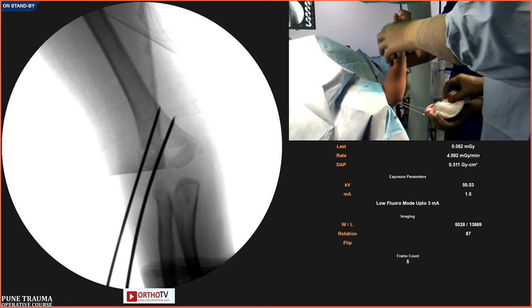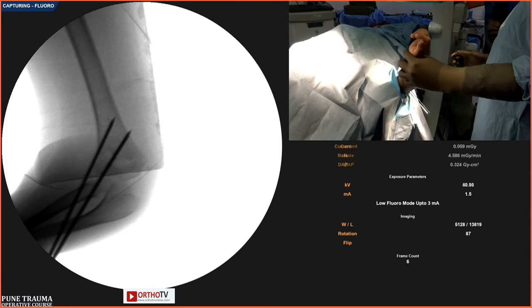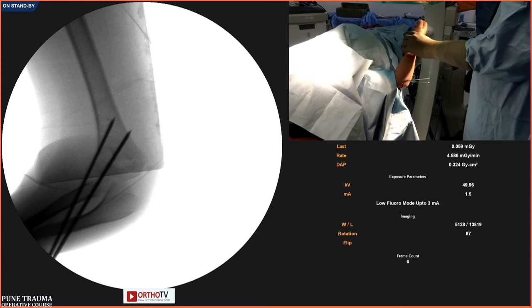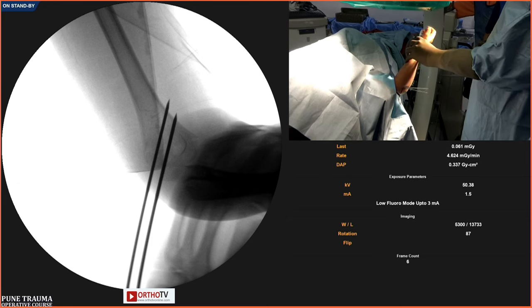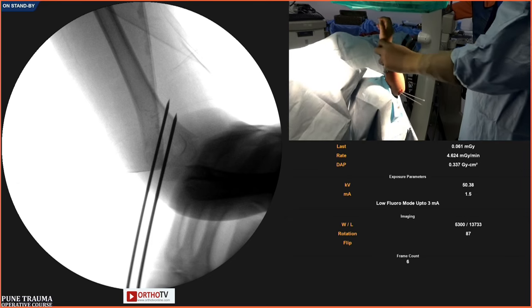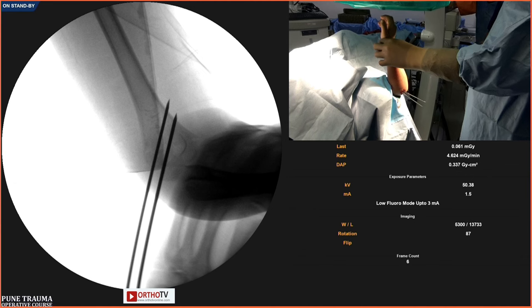And you want to check the stability of your fixation. What I do is the tape allows me to rotate. Shoot. So this is the column view. This is the external rotation view which showed you the medial column, and this shows you the lateral column. So you can rotate and check that there is no movement there and your stability is adequate. And both the pins are bicortical. One is a pillar pin, one is a fossa pin.